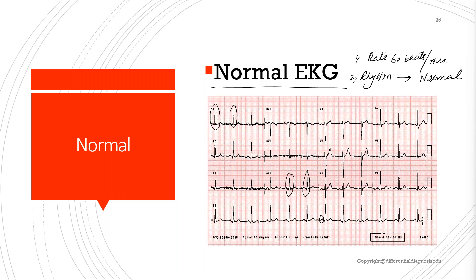Look for any conduction abnormalities. The PR interval is normal, so there are no conduction abnormalities present. Are there any ST or T wave abnormalities? There are no ST or T wave abnormalities present. You can go over all 12 leads — no T wave abnormalities present. So this is a normal EKG.